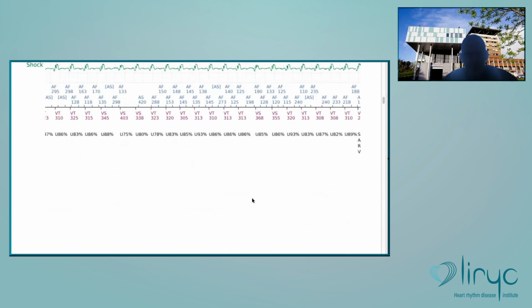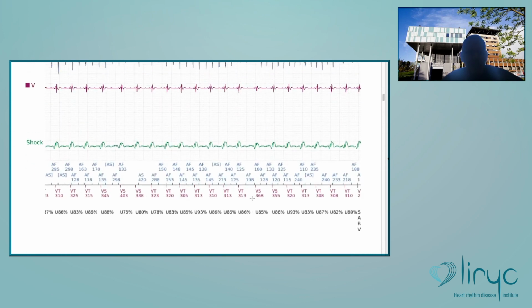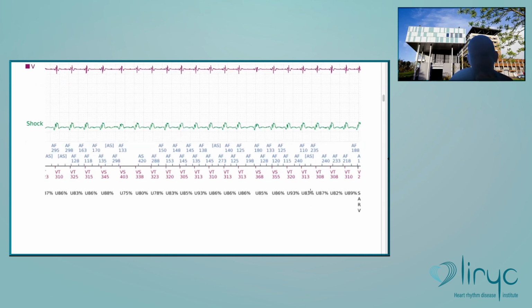And the problem is that, as I said, if you have a dual tachycardia, if the morphology signal is not perfect, you see that the threshold has not been correctly programmed. Here it's 94%, so not all the signals are correctly diagnosed. It will be correctly diagnosed if you program 83%. That's the threshold that we now try to program systematically.